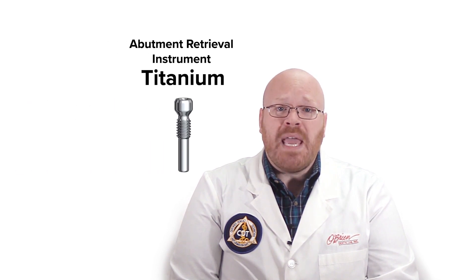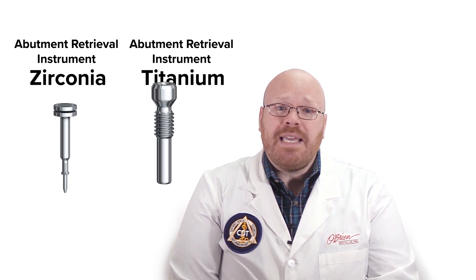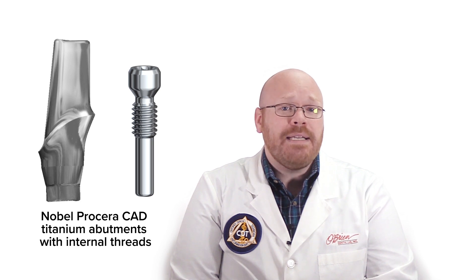The other two tools are each designed for a specific type of abutment: the Abutment Retrieval Instrument Titanium and the Abutment Retrieval Instrument Zirconia. The Titanium instrument is specifically for Nobel Procera CAD titanium abutments that have the internal screw threads. It looks similar to a normal screw, except that it's taller and the threads are higher up on the screw body. As you screw the retrieval tool into the abutment, the bottom of the tool makes contact with the bottom of the implant screw hole and forces the abutment up and out. This will only work for titanium abutments that have the internal threading.